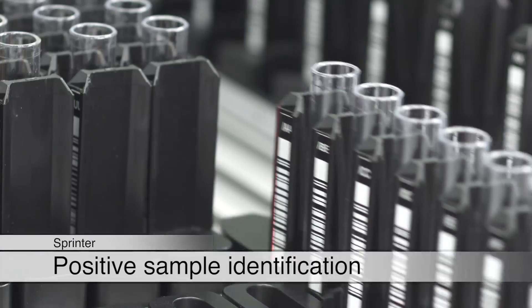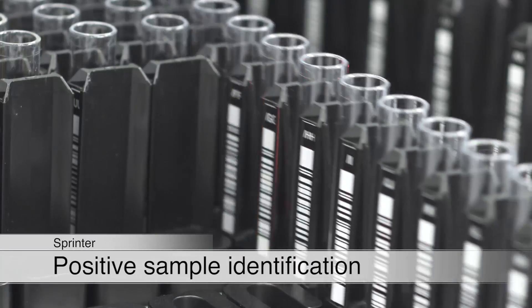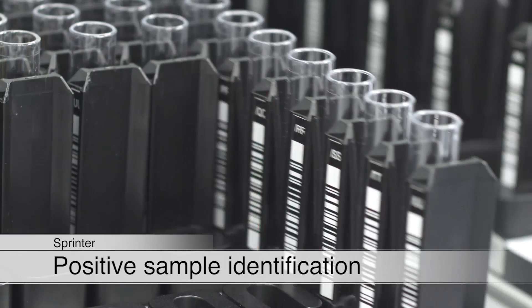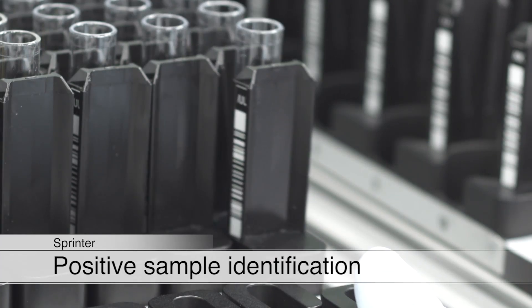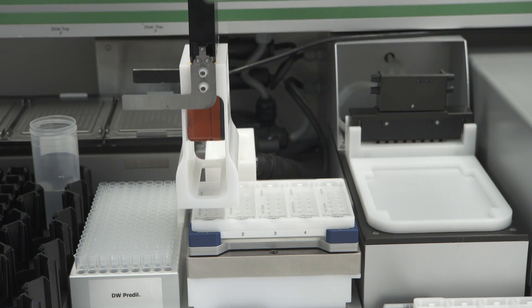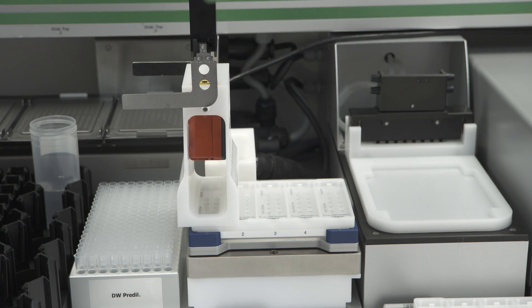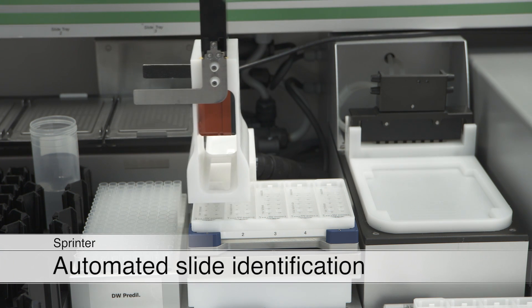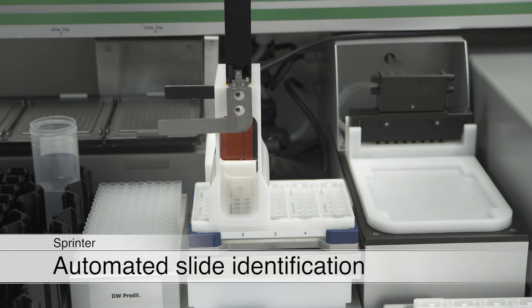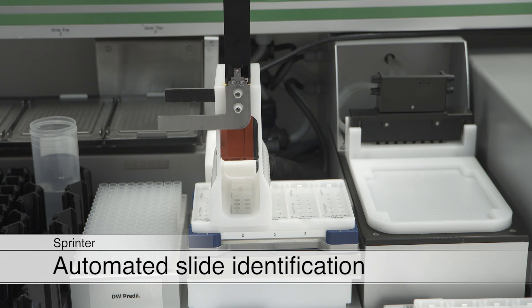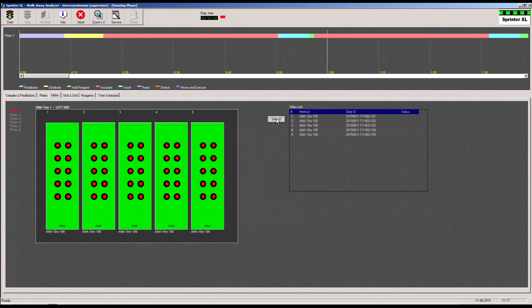The samples are clearly identified by their barcodes. For complete traceability of patient results, the object slides are also automatically identified. Especially in combination with the fully automated Euro-pattern microscope, this helps to close a safety gap in conventional IFA diagnostics.